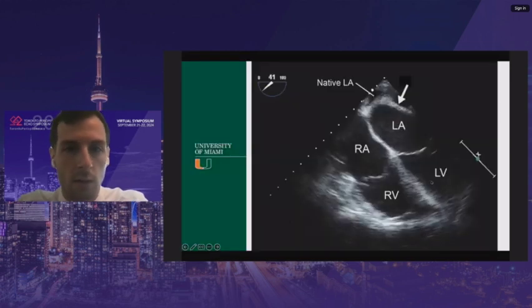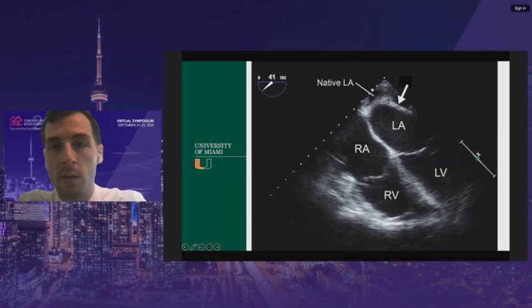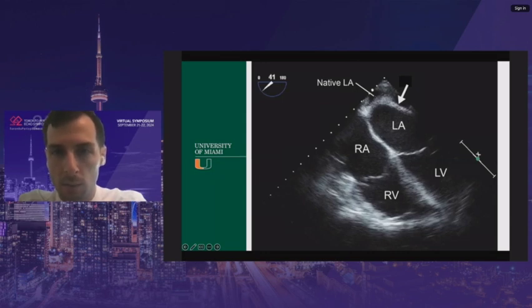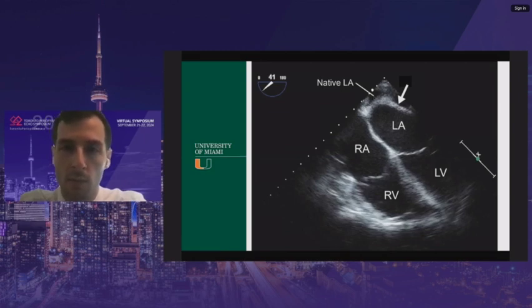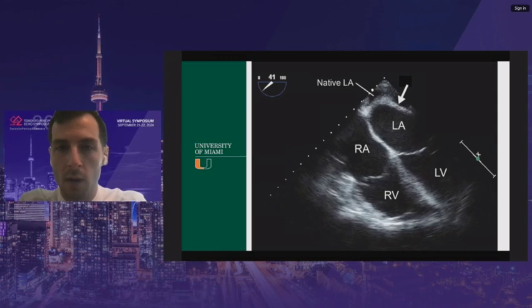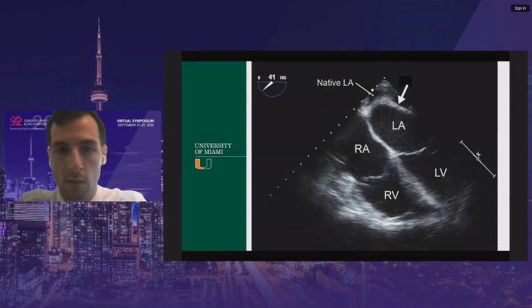The reason why the type matters is that after the transplant, on the posterior aspect of the left atrium, there can be hypoechoic areas. In instances of hypotension, you might think this could be a loculated effusion or blood clots compressing the LA — but actually it's completely normal.